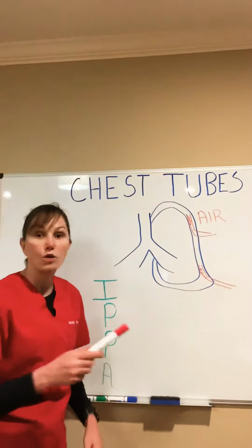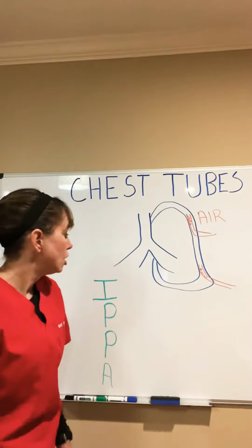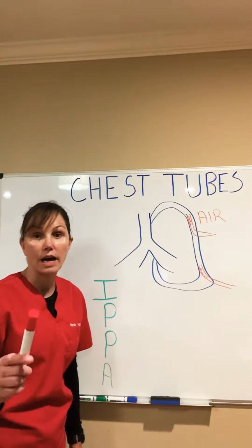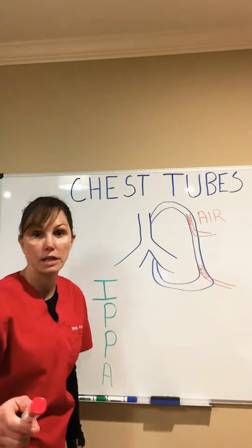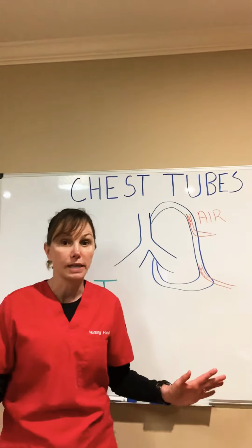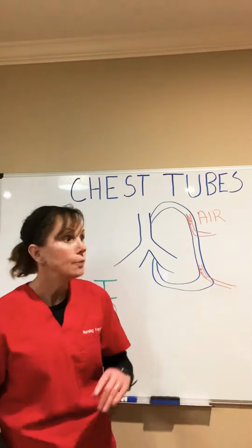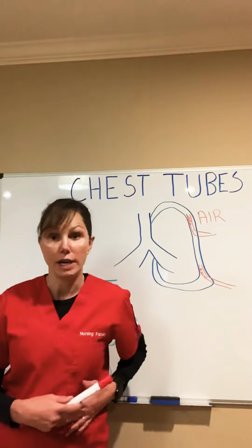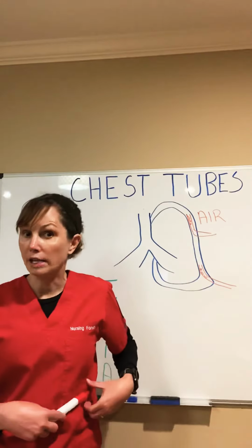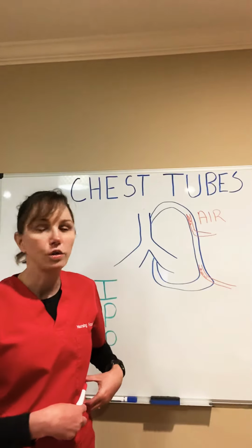So let's talk about assessment of chest tubes. What is your role, okay? Remember the order of assessment, and if you don't remember it, just use this phrase: I palpate perfectly, amen. So on inspection, you're going to come in, and if you're in the ICU, it's probably every 2 hours. If they've moved to the floor, the Med-Surg floor is probably going to be every 4 hours. You're going to expect the dressing to be dry and occlusive, okay? Usually you change that daily, so you're going to look at the site when you change it. You're going to note the sutures if there are sutures. You also look for signs of infection.